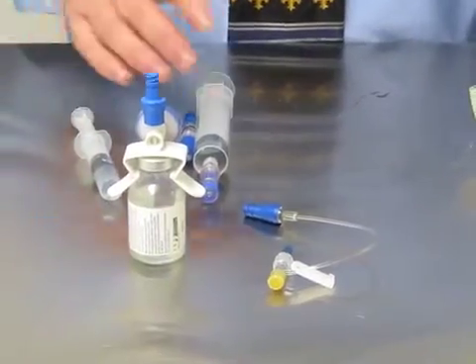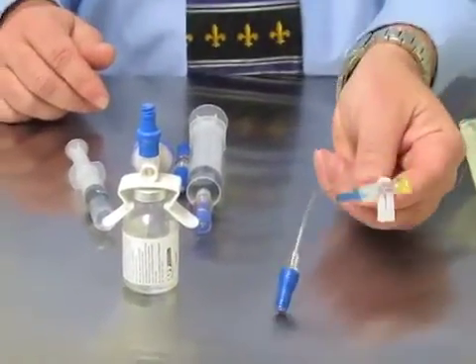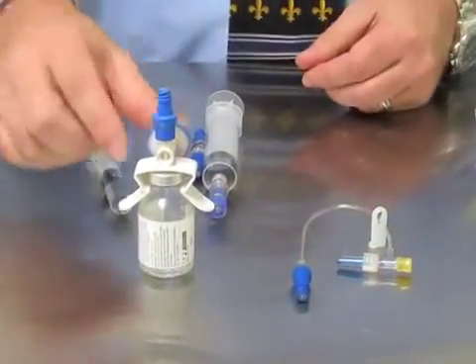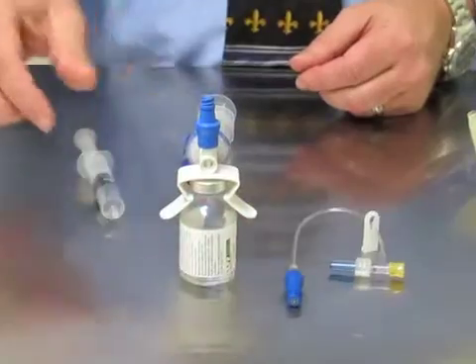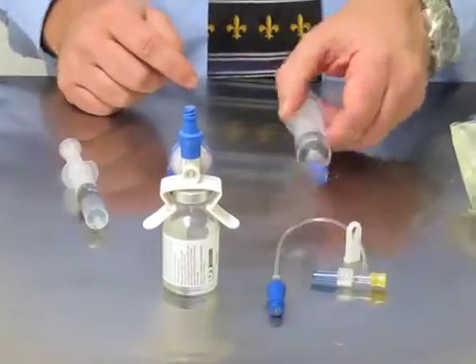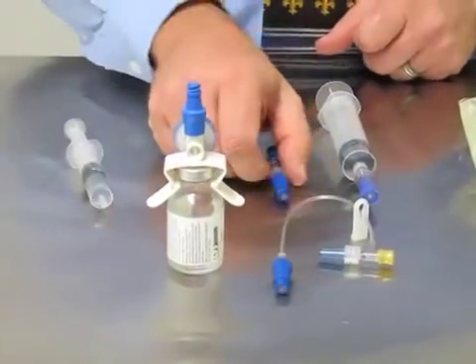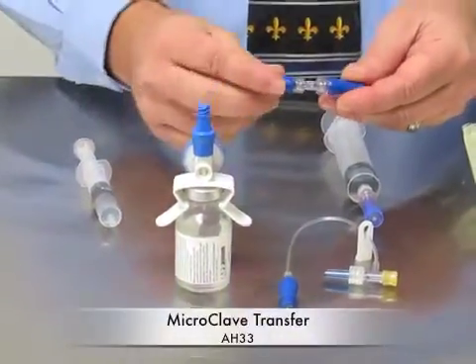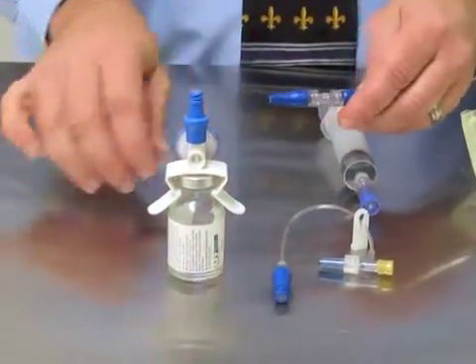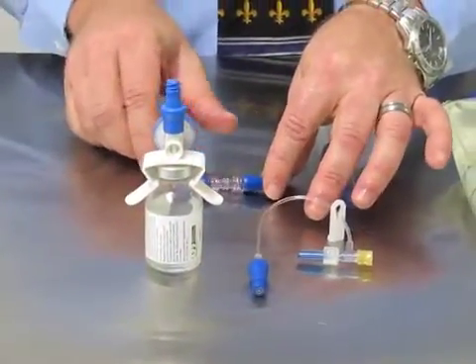Next, I'm going to simulate an IV push into an IV catheter. You'll need the microclave T-port or just a microclave attached to the IV catheter, your drug with a vial adapter, and a syringe with a Spiros attached. I'm going to simulate having to dilute this drug — this is the device we'll use: two microclaves back to back, so I'm able to hook a saline flush to dilute my drug.